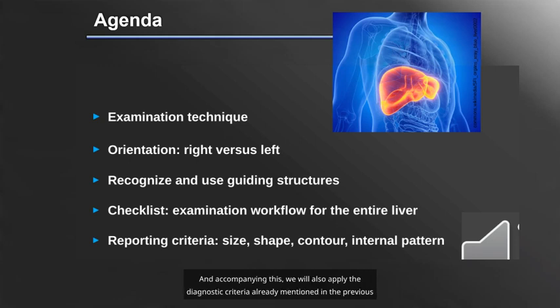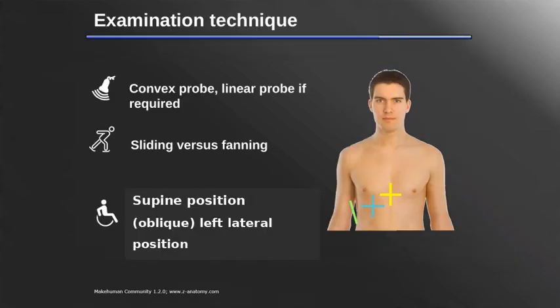And accompanying this, we will also apply the diagnostic criteria already mentioned in the previous presentations to the liver in terms of size, shape, contour, and internal pattern. Let's begin with the examination technique.